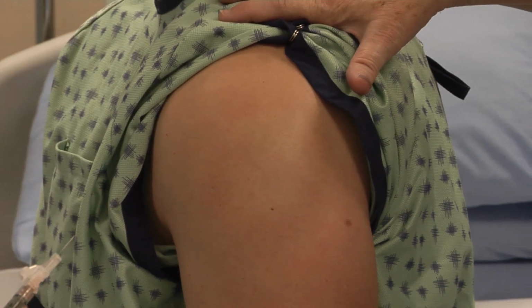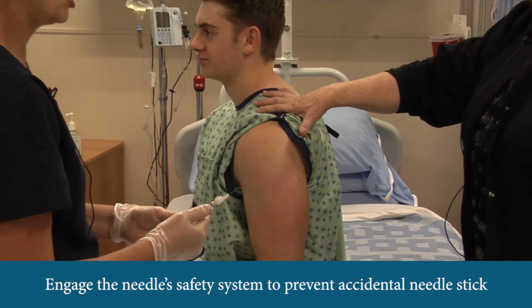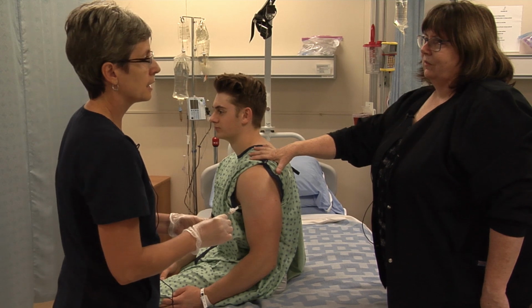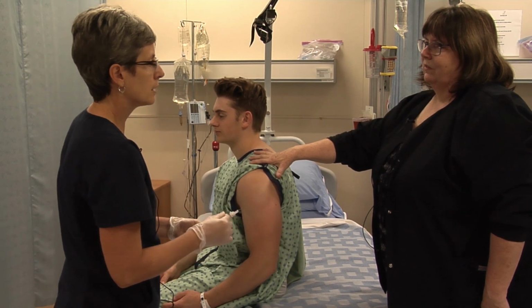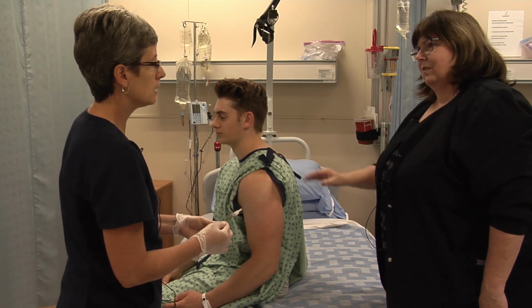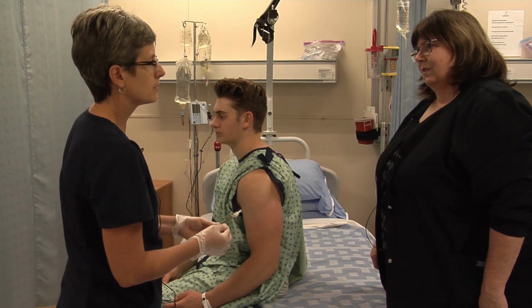And how fast do we inject in? It kind of depends on the medication. It can hurt when you're trying to put a volume into a muscle. Some medications are more painful than others. So this being 1/2 ml, I would say you could probably have that injected in about 10 seconds.